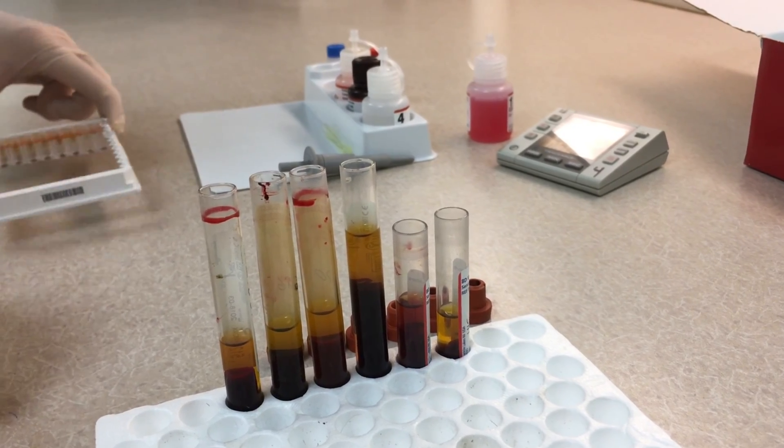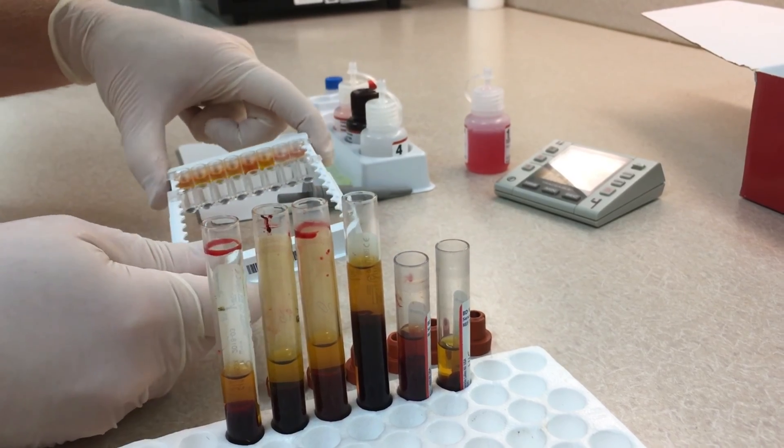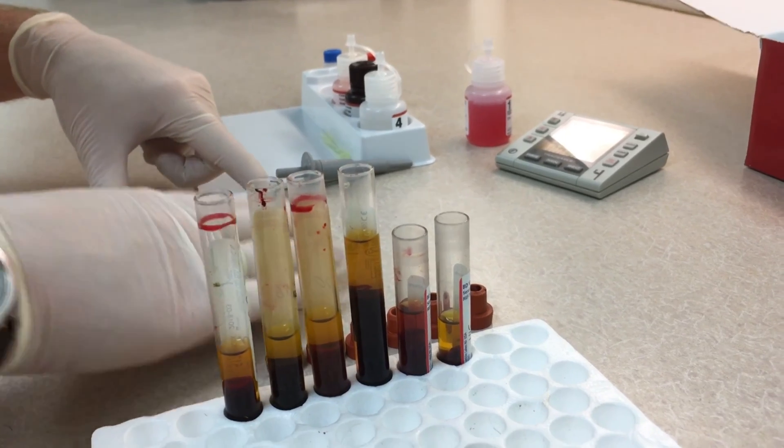That's going to line up with your plate. We have eight wells in a row, so you have a positive and negative control and then six samples in your wells. Make sure they line up so you can find your positives later.